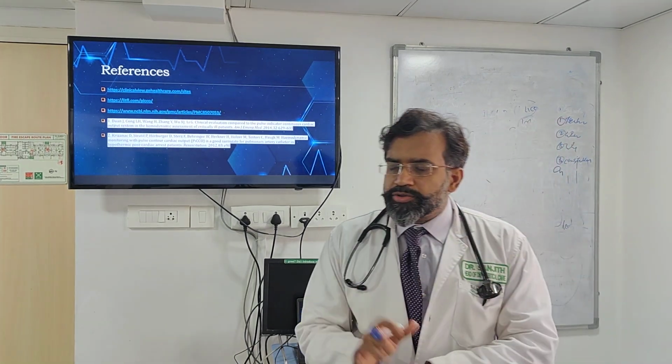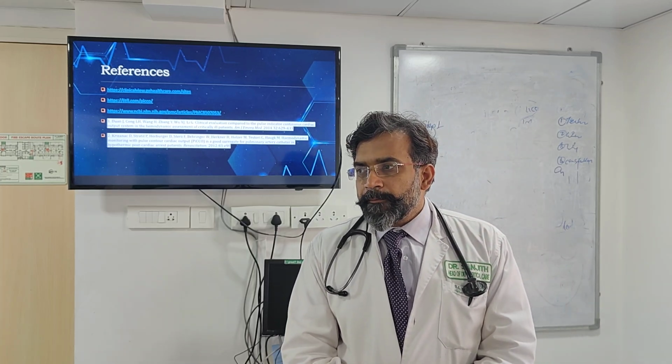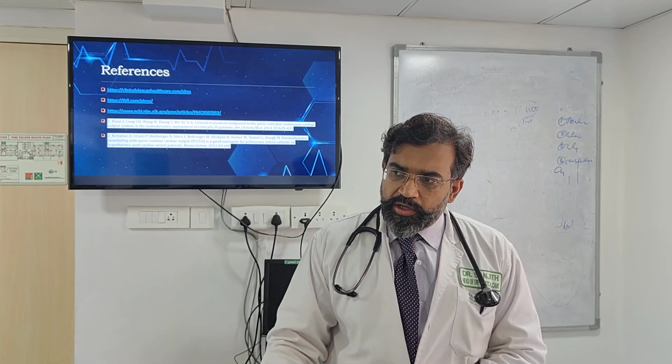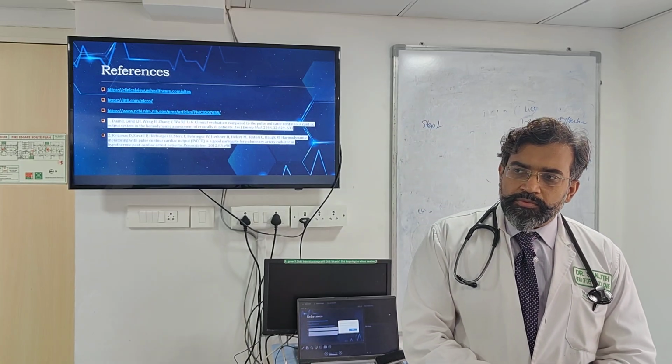Yes. How to do thermodilution? I'm asking you. You have to do thermodilution. What do you do? First enter the name. That has all been done. That's when you are actually instilling the first time. Name, age, sex, all that is put. Now the procedure of thermodilution. What are you going to do? Take cold saline? No.